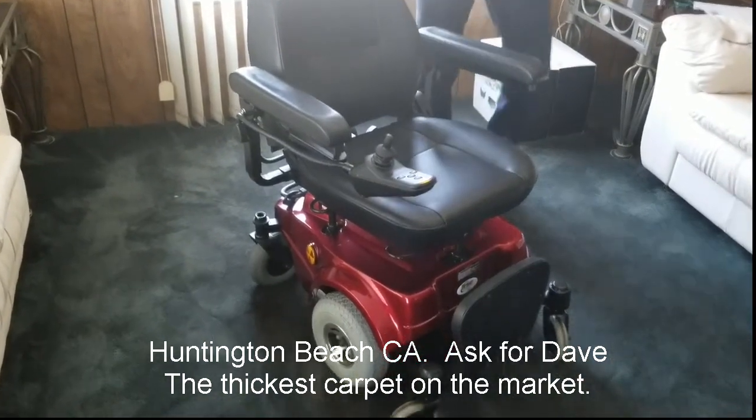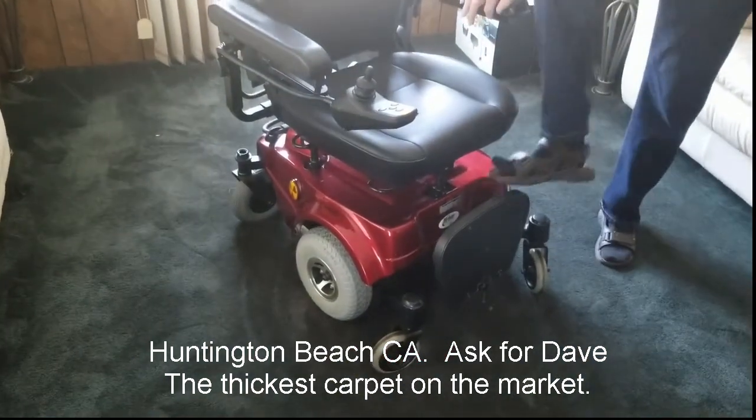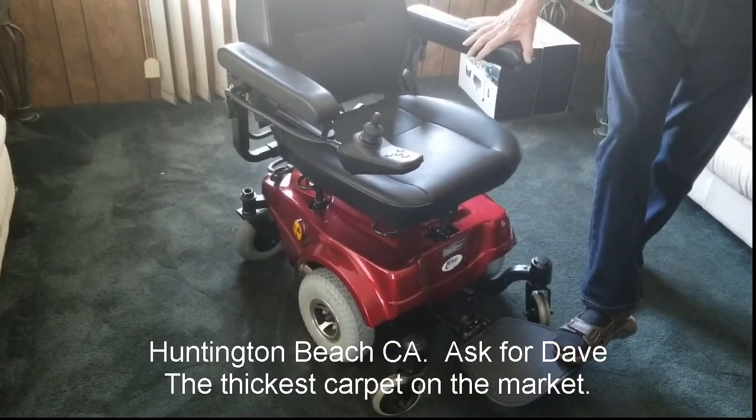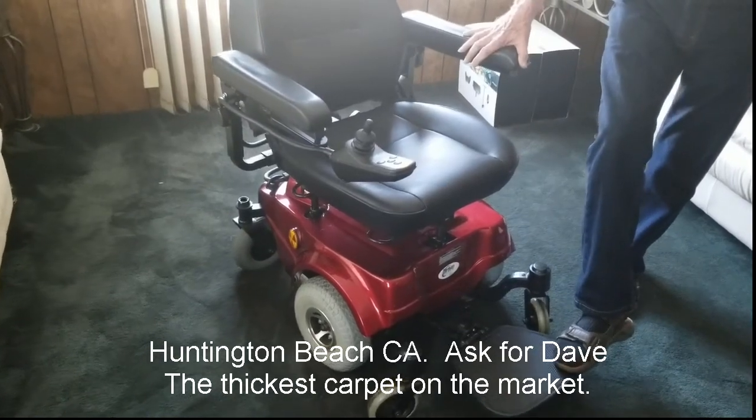The battery is only about six months old. We bought this for my sister, who sadly passed away. We've had it for about six months. It's a 10-year-old chair.